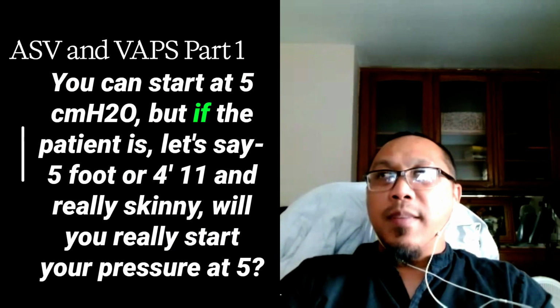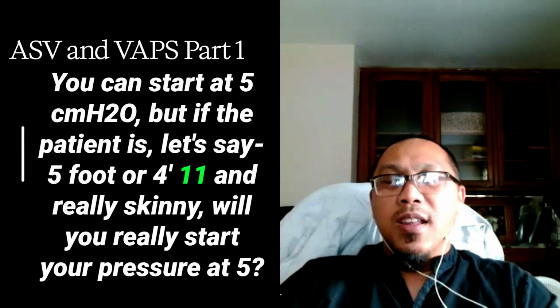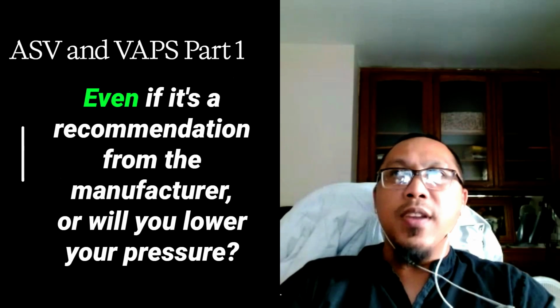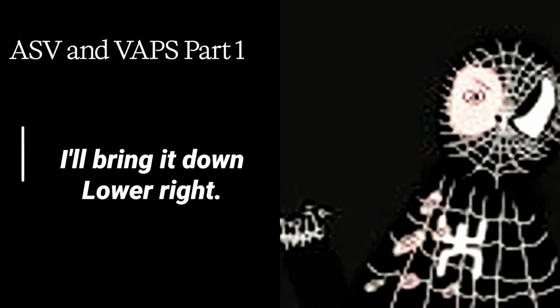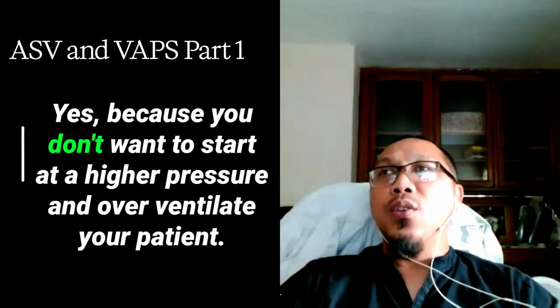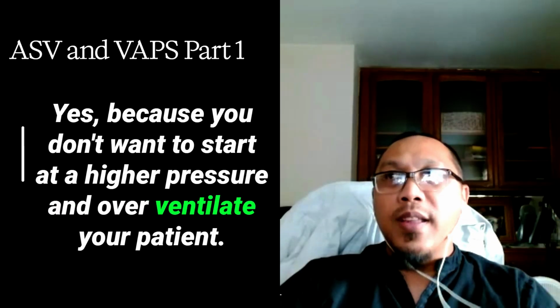But if the patient is, let's say, 5 foot or 4'11" and really skinny, will you really start your pressure at 5? Even if it's a recommendation from the manufacturer? Or will you lower your pressure? What do you say? Bring it down. Sure. Lower, right?